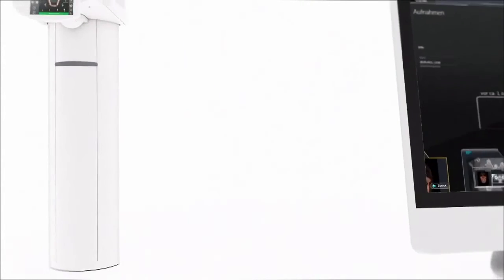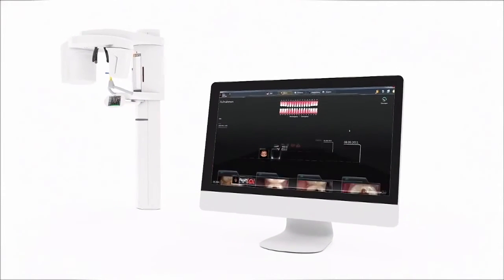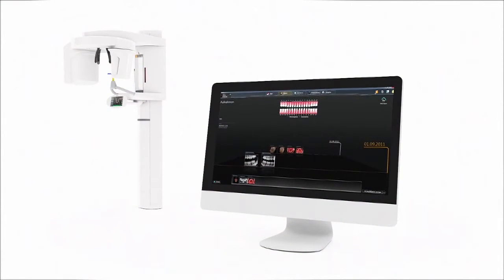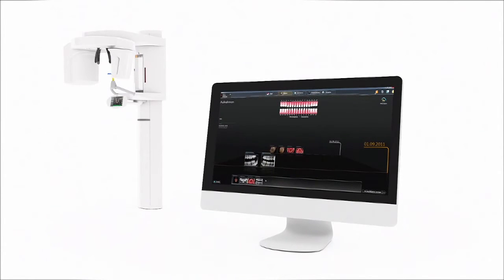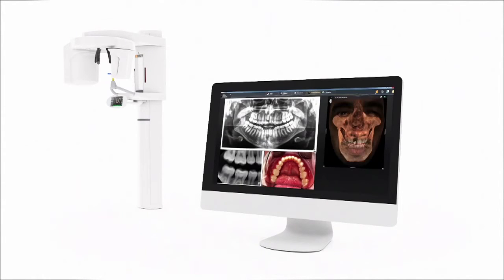To match the ease of use of Orthophos SL is the simplicity of Sodexis 4. The modern software represents x-ray efficiency, facilitates patient interaction, and increases treatment acceptance.